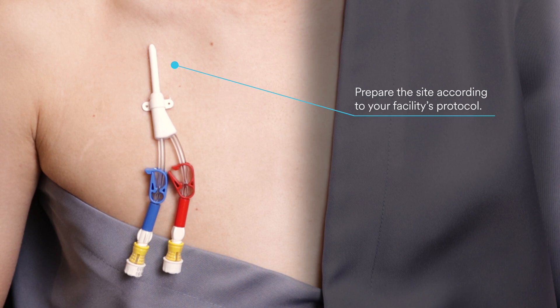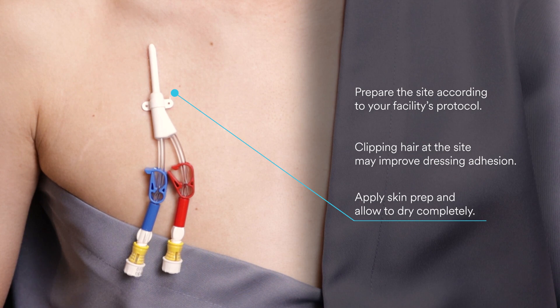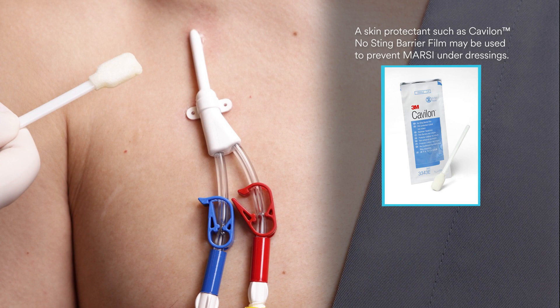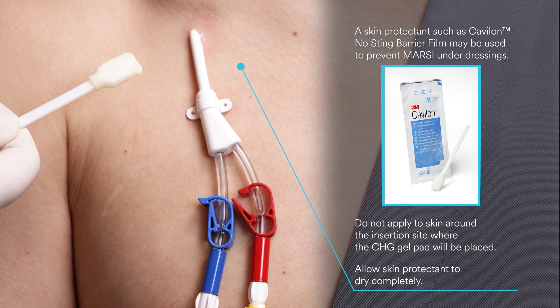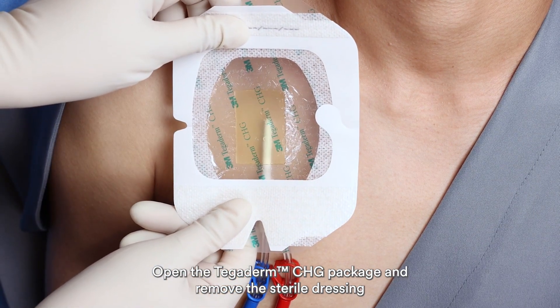Prepare the site according to your facility's protocol. Apply skin prep and allow to dry completely. A skin protectant such as Cavilon No Sting Barrier Film may be used to prevent MARSI under dressings. Do not apply to skin around the insertion site where the CHG gel pad will be placed. Allow skin protectant to dry completely. Open the Tegaderm CHG package and remove the sterile dressing.